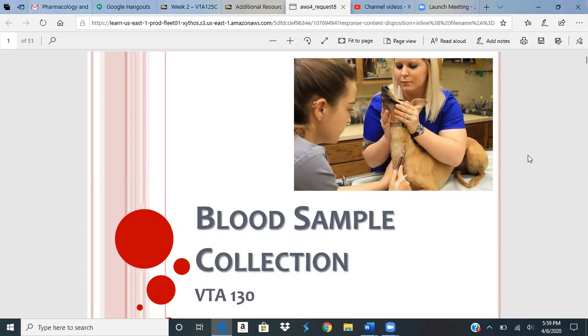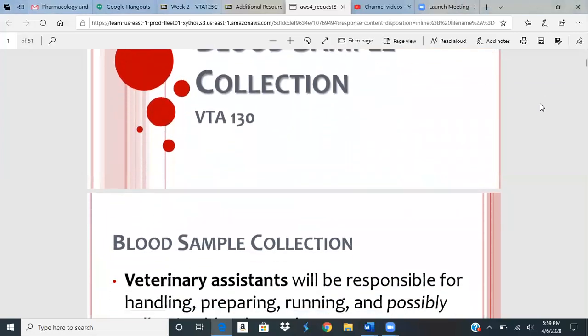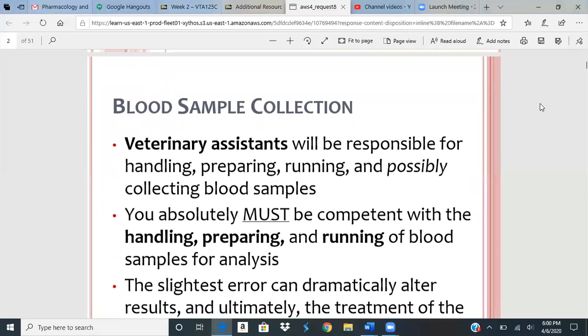Blood sample collection is huge, of course, for veterinary medicine. Just like human medicine, we need to get blood to figure out what's going on with our patients. So we teach you some of the basic ways to collect the blood. As an assistant, you also will need to know which blood tubes to use. So when we say, okay, we're going to run a CBC, we're going to run a chemistry, you'll need to know, okay, well, I need to grab this tube and this tube and this syringe and everything. And we teach you, of course, which tubes to use. So we're going to start here.